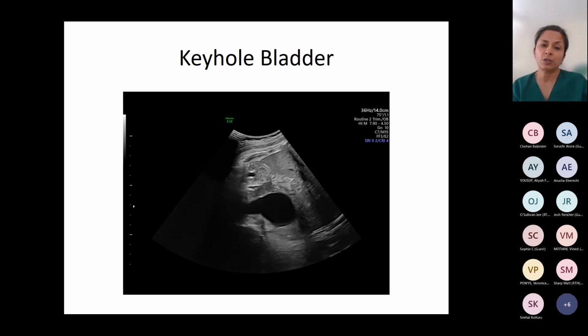So of course, partial urethral obstruction, because if it was complete, then the bladder would be very big. That kind of complete urethral obstruction we would identify very early on in the pregnancy, probably around 12 weeks, with a bladder that's filling the whole abdomen. This is partial urethral obstruction.